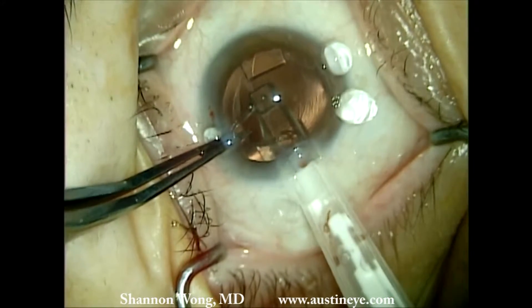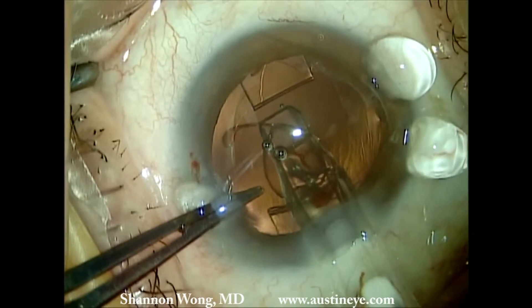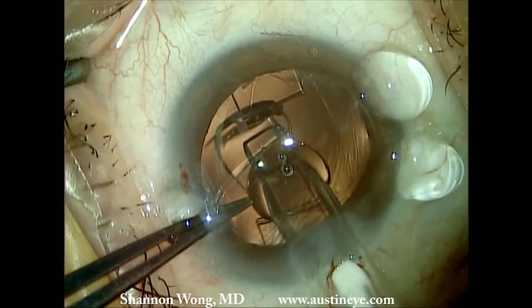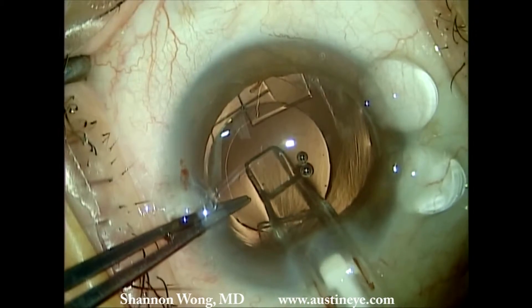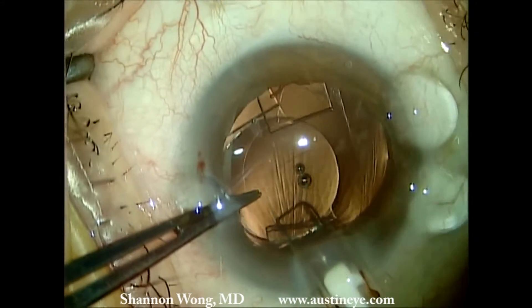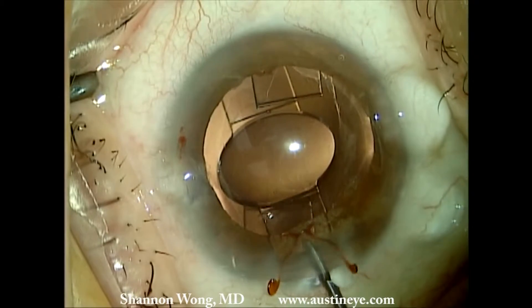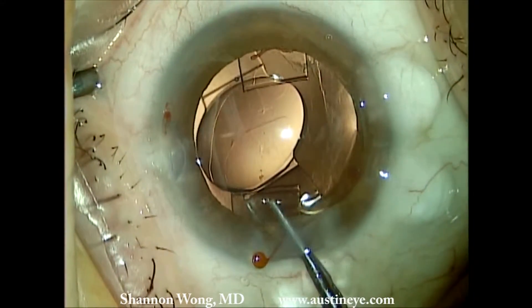We then reinsert a new crystal lens of the same dioptric power. As there has been an anterior capsule extension that you can see at 12 o'clock, we're careful to very slowly and gently insert the second crystal lens in a way that does not inadvertently extend the anterior capsule defect at 12 o'clock.